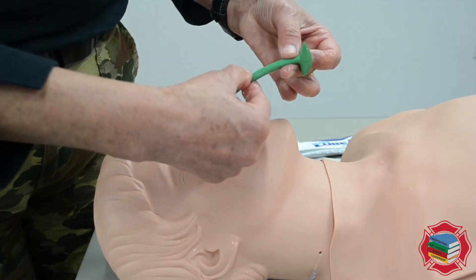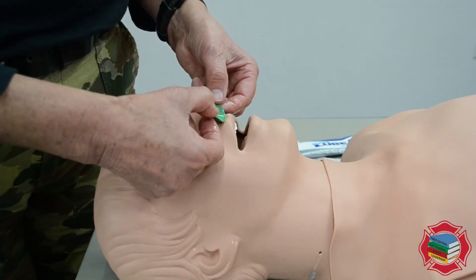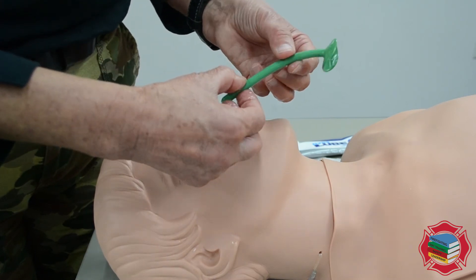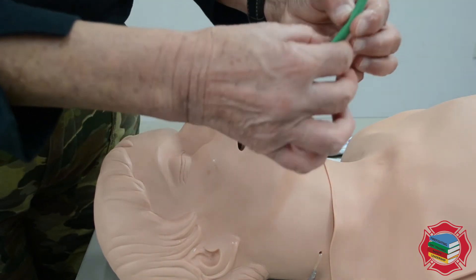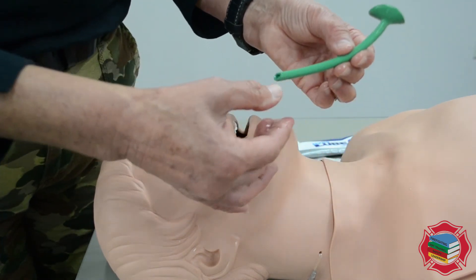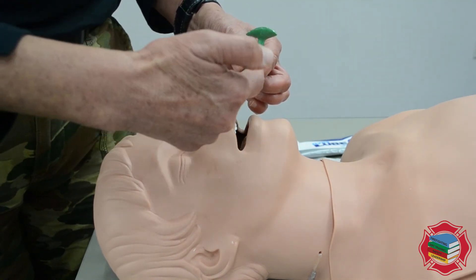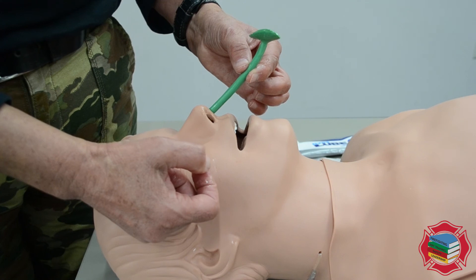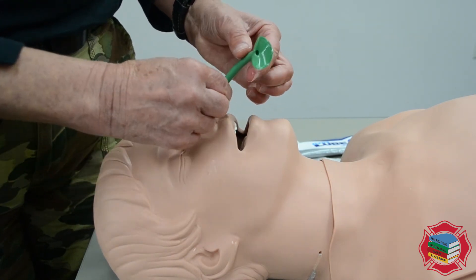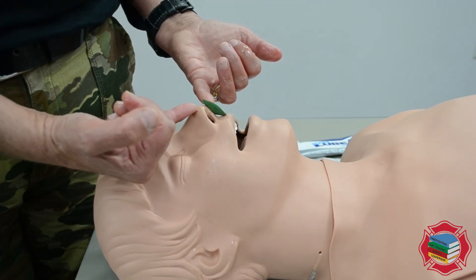You'll see I'm putting this airway in with the bevel facing the septum. It really is made for the right nare because the curve follows the curve of the nasal pharynx. In this mannequin it goes in quite easily. If I had to insert it into the other nare, I would remove it, re-lubricate it, and insert it. You'll notice the curve no longer approximates the curve of the nasal pharynx, so on a patient when it meets resistance, you would just rotate it and drop it in. The flange should rest right on the nare.